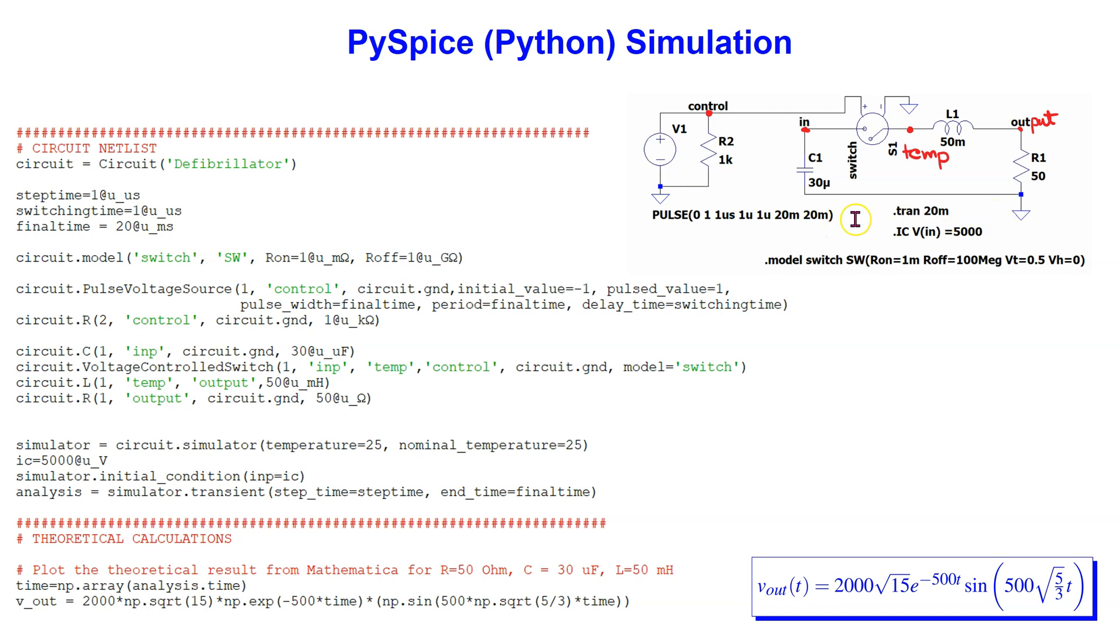Using descriptive node labeling, we can translate the circuit into a netlist as shown here. We define the initial voltage across the capacitor as shown here.